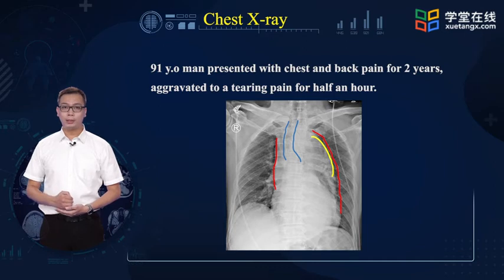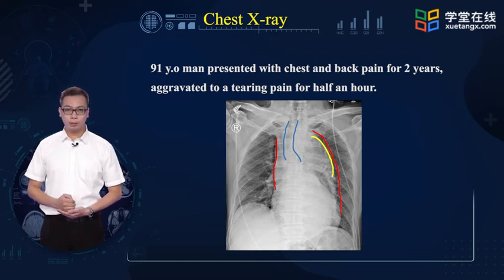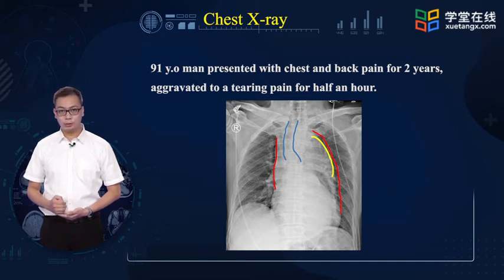There are other indirect associated radiography findings not shown in this case, including calcium sign, which means inward displacement of calcified intima over 1 cm, pleural effusion, and depression of the left main bronchus. However, the chest film findings are of low specificity, as many other conditions can cause similar changes.